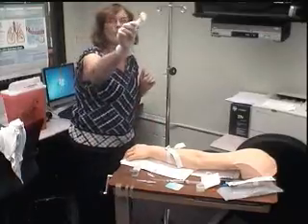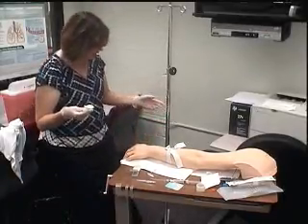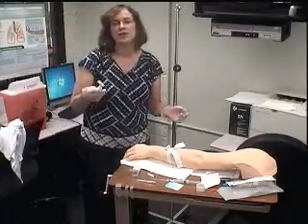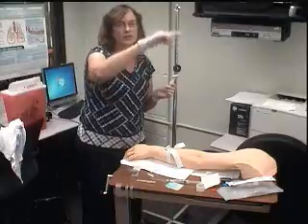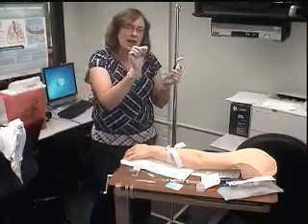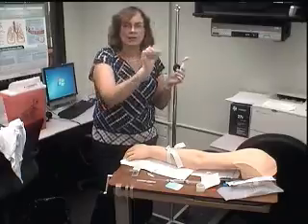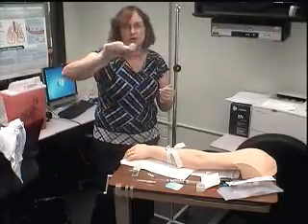So I squeeze open my ChloraPrep. With ChloraPrep, it's a scrubbing motion that kills. Like you normally do a dressing, it starts from the center and then goes to the outside when you're doing any kind of wound care. Well, it's a little different. If you did alcohol, you would start from the center and go out like when we do our IM injections. But with ChloraPrep, it's scrub, scrub, scrub.